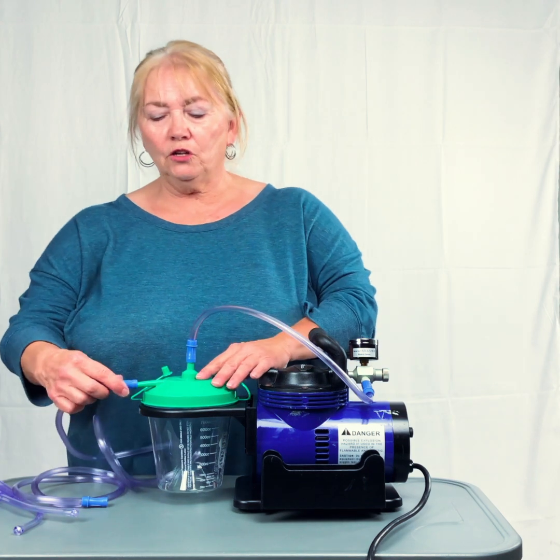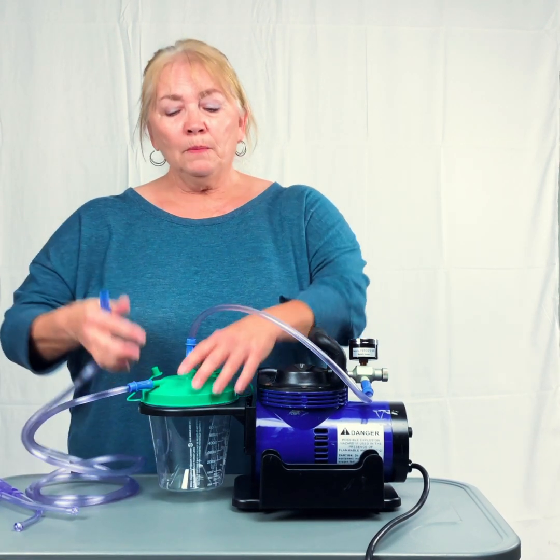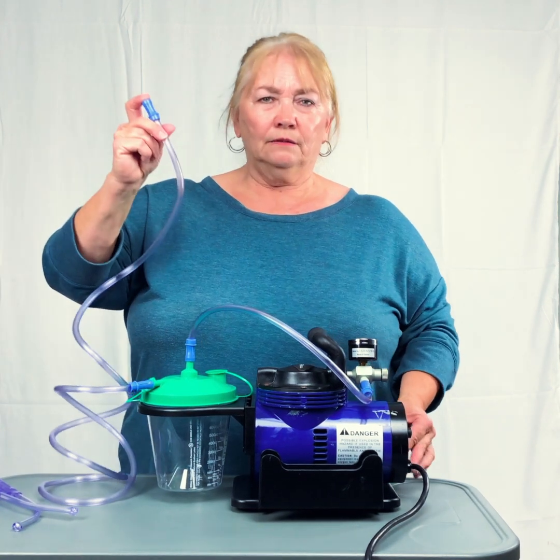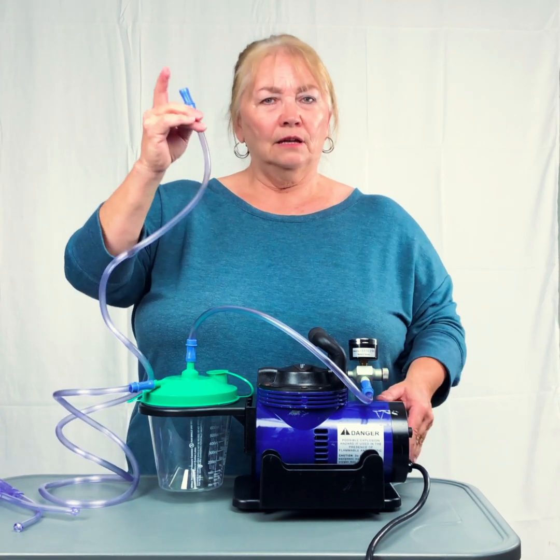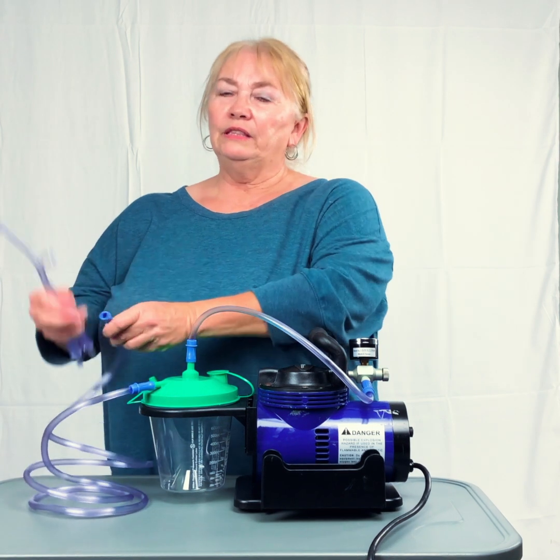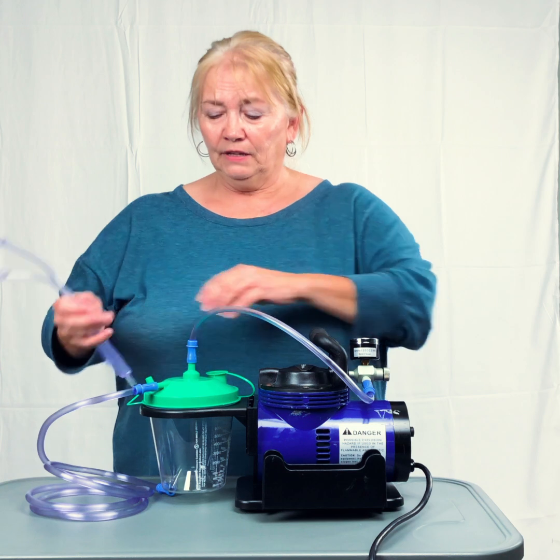So we know our canister is good. Now we're going to hook up the long tubing. We're going to repeat the process. Again, remember, it has to suck all the air out of the canister as well as out of the tubing. I have suction. So we're good. Now we know that this is totally fine.